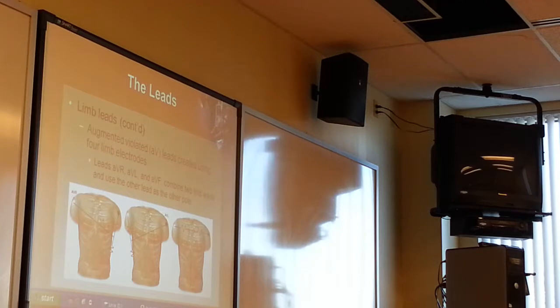Okay, the AV leads. For the 4 limbs, leads AVR, AVL, and AVF combine 2 limb leads and use the other lead as their pole. So, right, what you said.